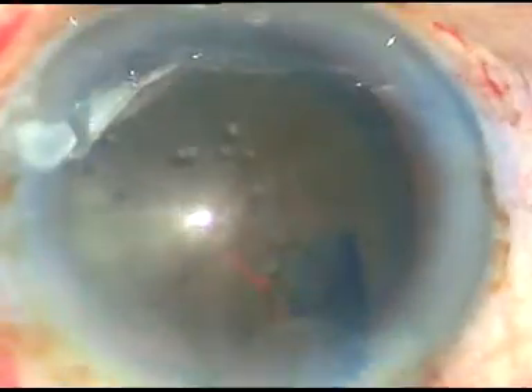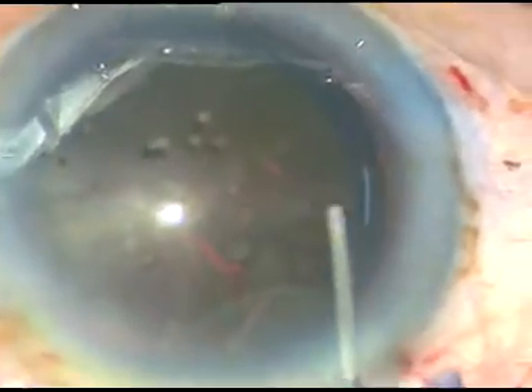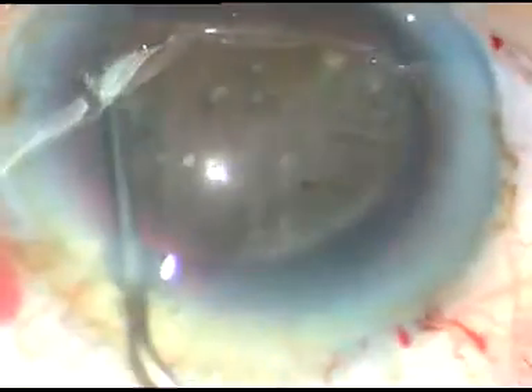Now, hydrodissection. A 27-gauge cannula with BSS is used. We go just underneath the anterior capsular rim and inject a very adequate amount of fluid. The nucleus is elevated and it is mobilized.